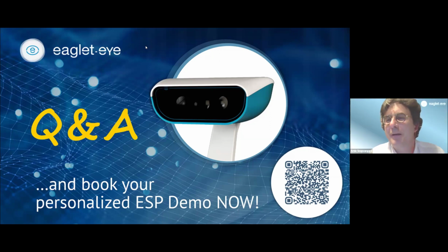Yeah, and I'd like to point out to all of the listeners or all the people participating here that we have user forum webinars. These are exclusively for users, and in the last one, we actually covered how you can detect, using the tangent angles map, which is a unique map for the ESP, whether there's an imprint from the scleral lens.